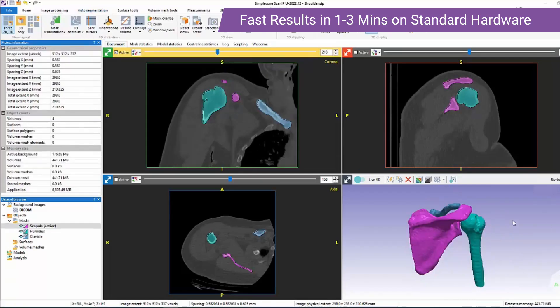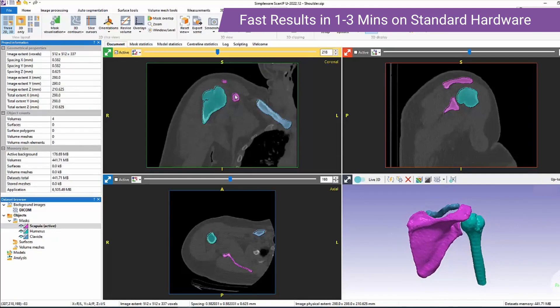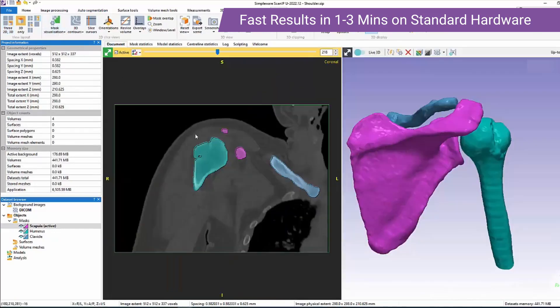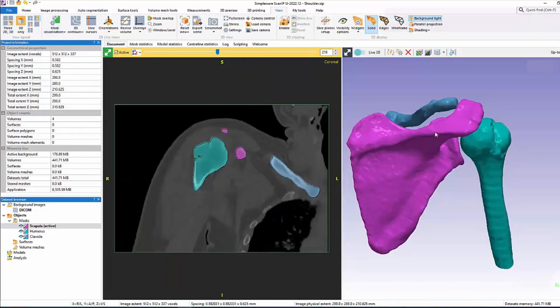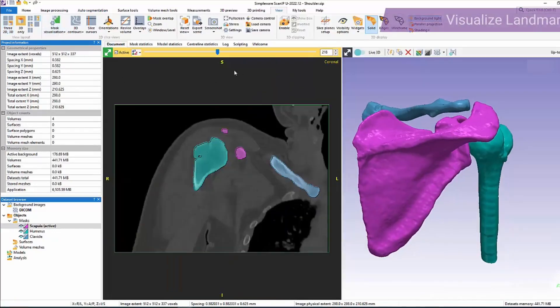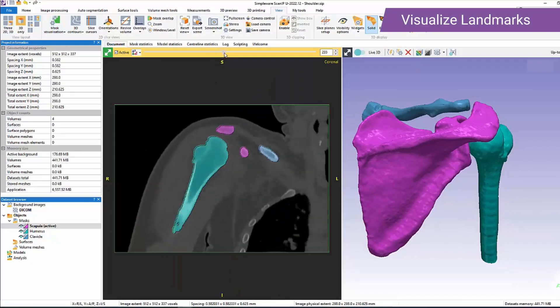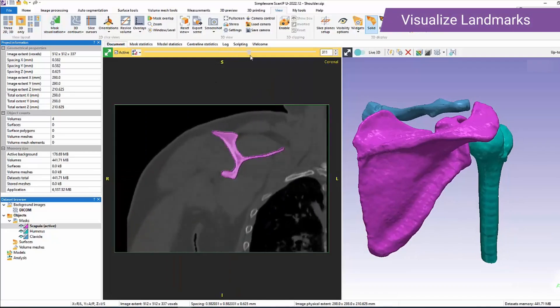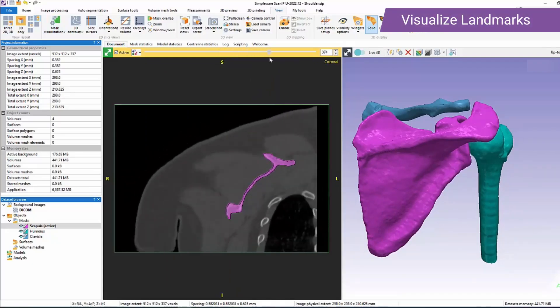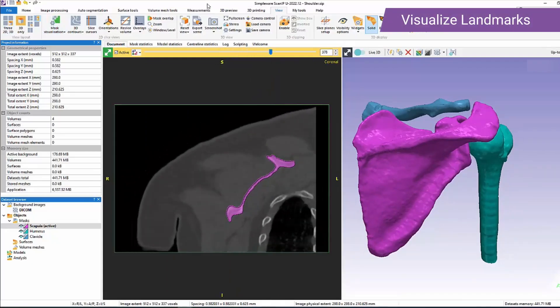Here you can see the output of the shoulder CT auto-segmenter. As you can see, the tool segments the humerus, scapula, and clavicle. We also have the automatically positioned anatomical landmarks, which are visible through the measurements tab.